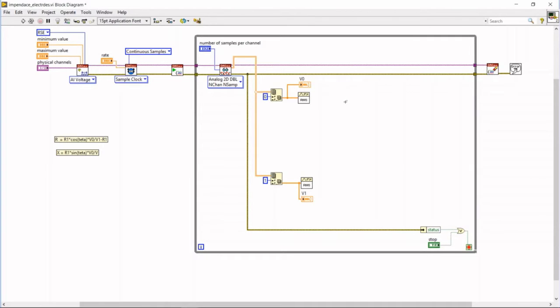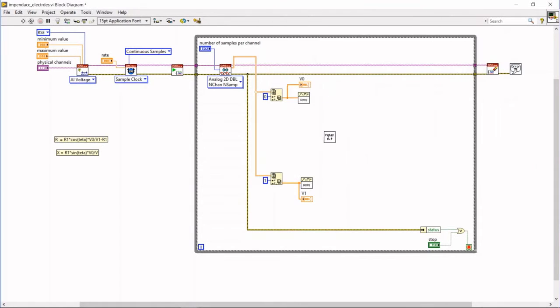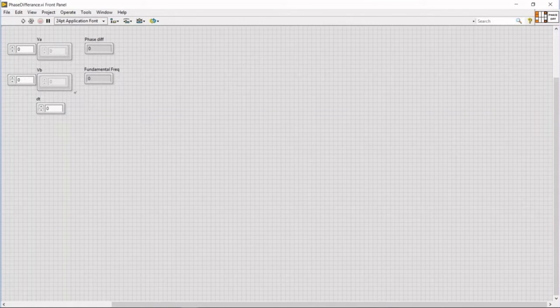So how do we get our phase difference? I'm going to use a block that I made, it's called phase difference, and I'm going to show you how I code it. So our inputs are VA and VB, that is our V0 and V1. Also DT, that is period that we're going to use to calculate the fundamental frequency, and the outputs are that phase difference that we need and fundamental frequency.